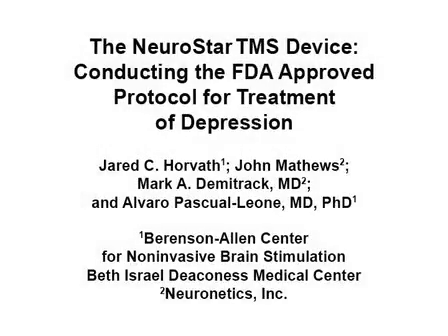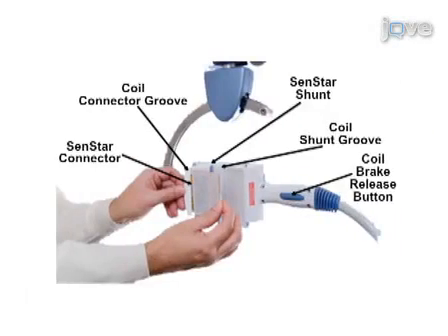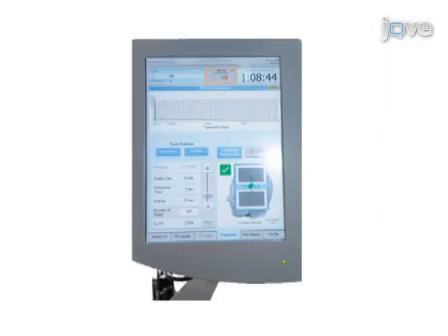The overall goal of this procedure is to examine the procedure and considerations relevant to the FDA-cleared depression treatment protocol using the Neuronetics NeuroStar TMS therapy system. This is accomplished by first prepping the machine and accessing any patient-related settings and material.